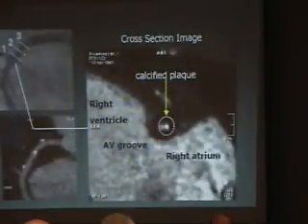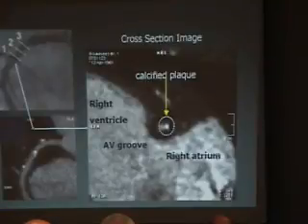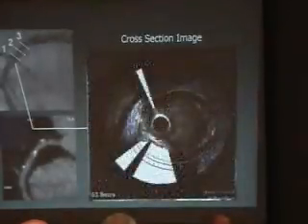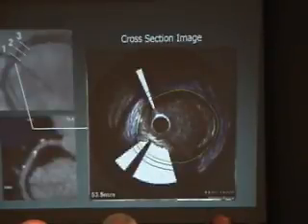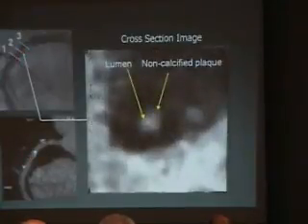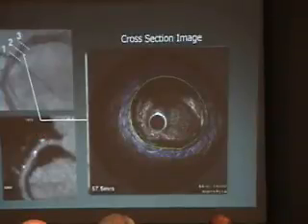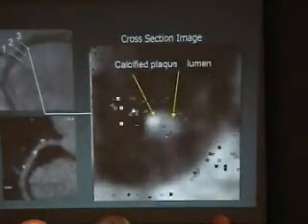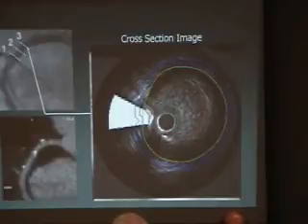Now, to come back to the work that was done on IVUS and multi-slice CT scan, this is the angiography, and this is the multi-slice CT scan. You see here in the AV groove between the right atrium and the right ventricle, in this cross-section, you can zoom and clearly see the lumen and the calcium in the plaque. That's how it looks on IVUS. You can take another region where there is basically no calcium, zoom again, and you will see only the lumen opacified by the contrast without calcified plaque. A little bit further, this is the IVUS, we find another site with the lumen and the calcium, and again on IVUS, you will find this calcium and quantify it.